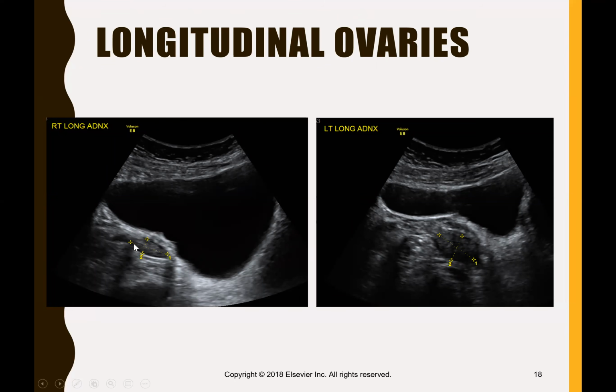These are little ovaries. A lot of people, students and sonographers, really struggle getting the ovaries on transabdominal because they're so small, and their echogenicity sometimes can just be almost exactly the same as the surrounding bowel muscle. So it takes practice to be able to identify them.